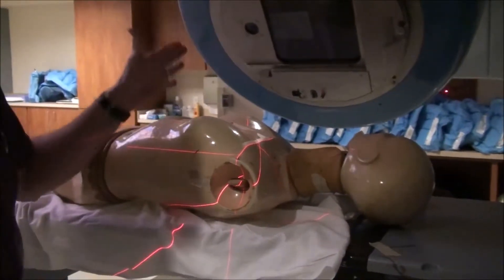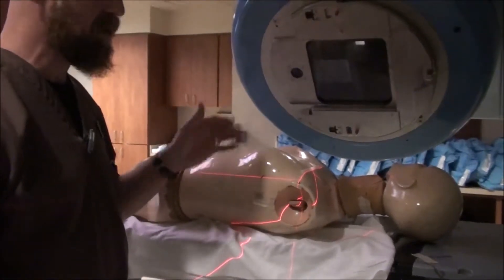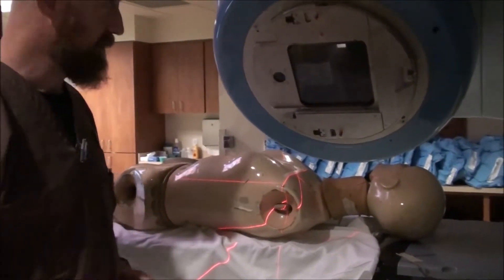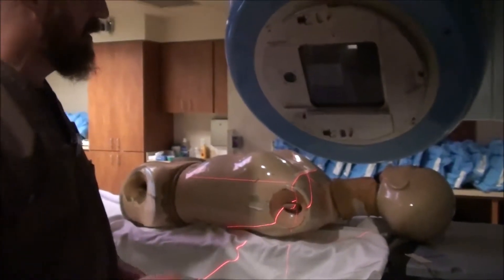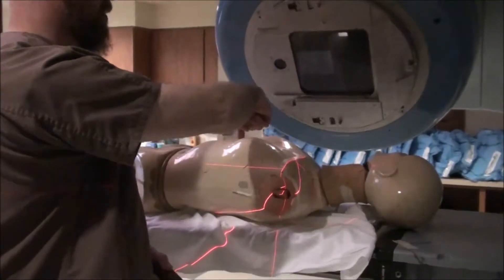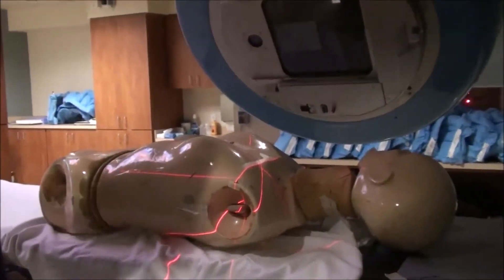This only works for a 20 centimeter long field or shorter. If you've got a big field, you're not going to be able to do this because you've only got 20 centimeters to work with from a 40 by 40. So you're still going to simulate this pretty much the same way. Your CR is going to be up here, but you have this aspect down here that you're working with.